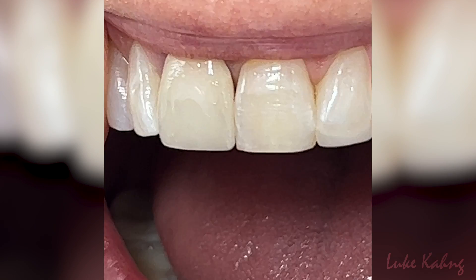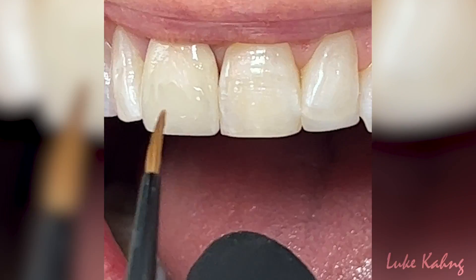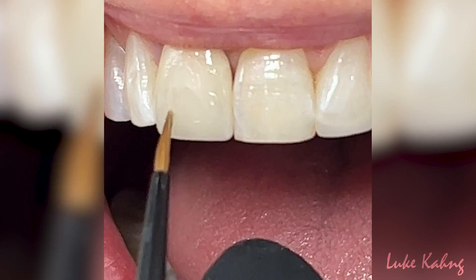Now I'm going to isolate a little bit more the mamelon. There's a lot of color inside.